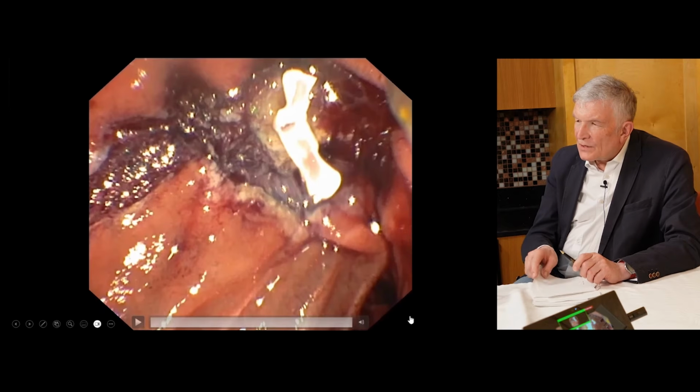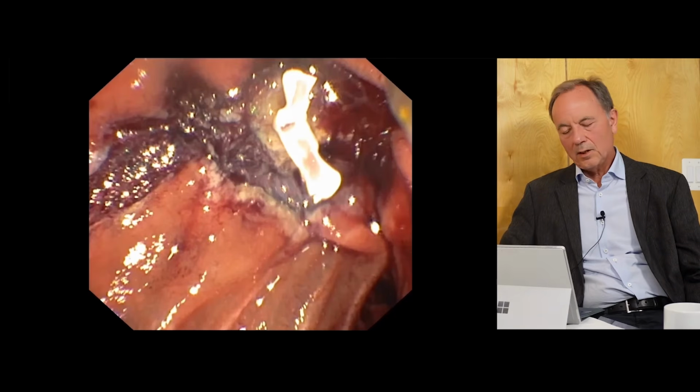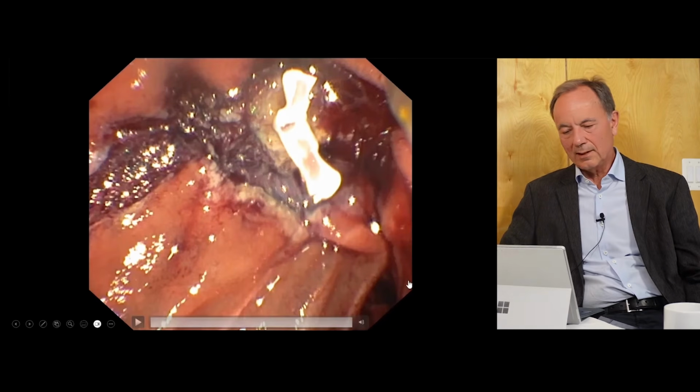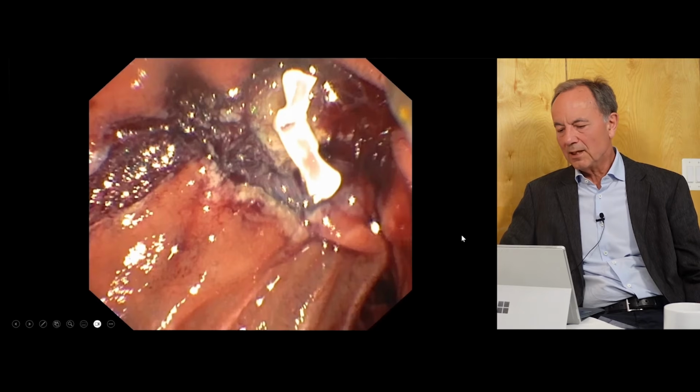If you look at the resection site here, do you do anything preventive against bleeding, or is it useless or only dangerous? Nobody knows if it's useful or useless. So if I don't see a spurter here, an ongoing bleeding, then I wouldn't proceed with electrocoagulation or whatever. Of course, we can consider using a hemostatic powder, but I'm not so convinced that it really prevents the rebleeding.